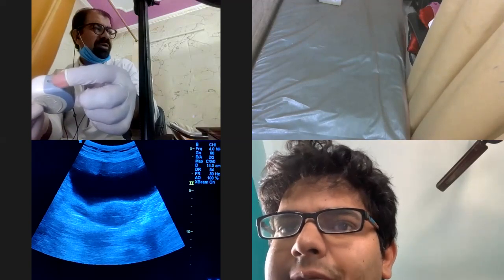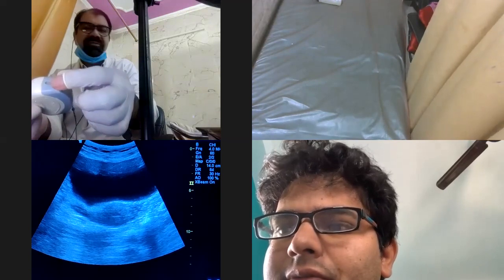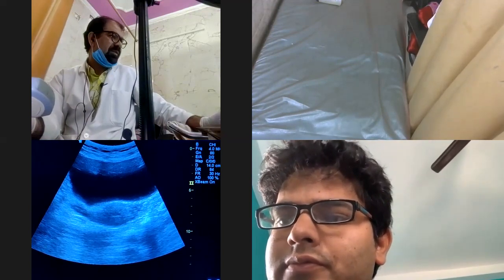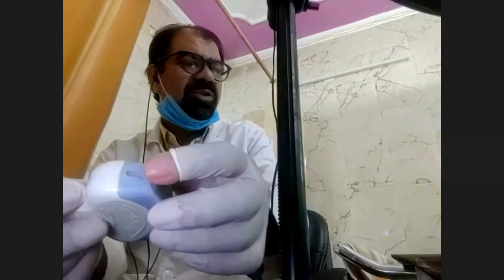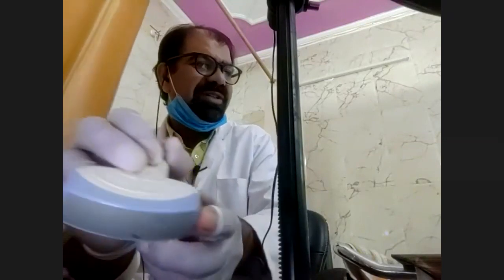I will show you. Wait. Now tell me, can you see this? Yes, sir. Now this was the indicator which I was telling you about. Done? So this indicator has to be towards the patient's right.